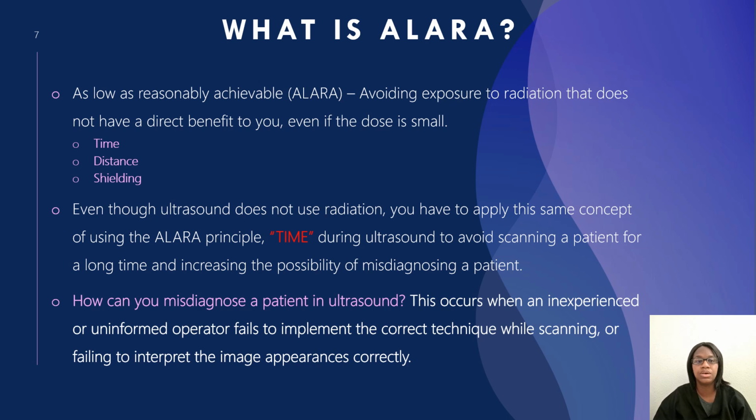So when it comes to ultrasound, we do not have to shield because it doesn't use radiation. You do not have to really worry about the distance because there's no radiation involved, but you do have to worry about your distance between you and your patient. You want to try to bring your patient as close to you as possible so that you aren't stretching over and causing injuries to your shoulder because we do not want to injure our shoulder.